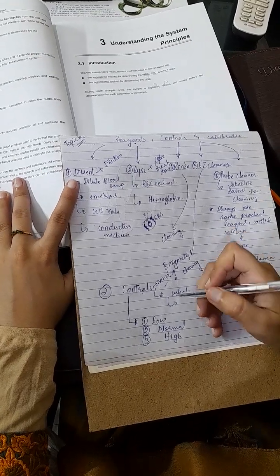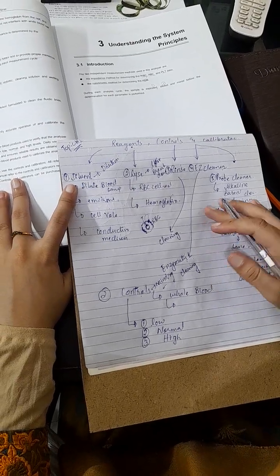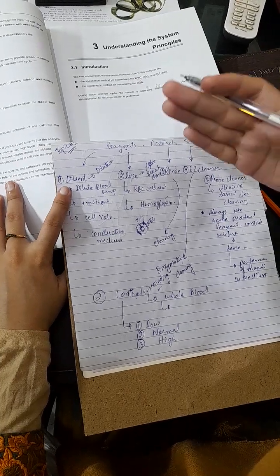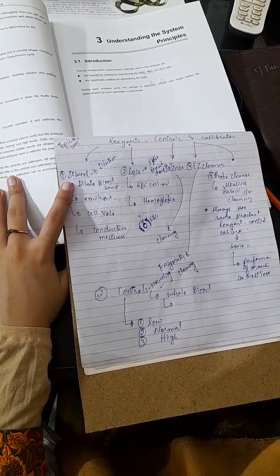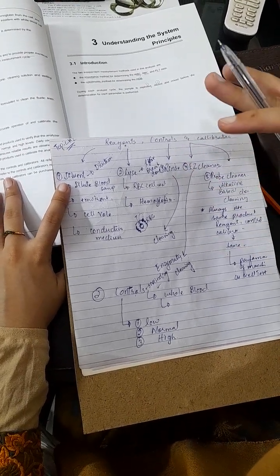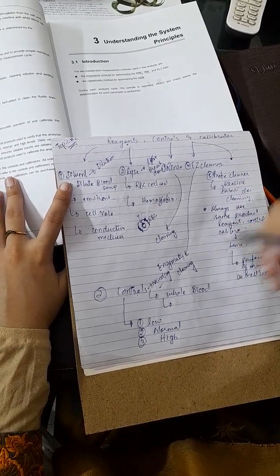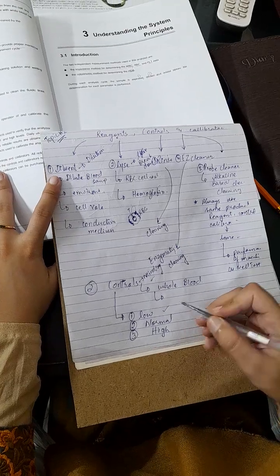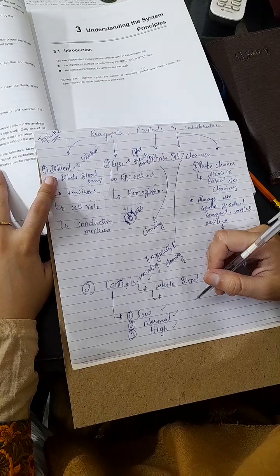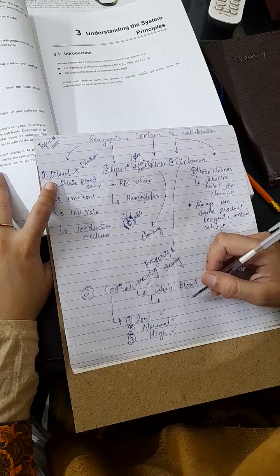Controls are commercially prepared from whole blood and used to verify whether the analyzer is functioning properly or not. If the controls are not within the limits provided by Mindray, or if we use a third party's or make them ourselves, and they are not in the range, it means that our machine is not working properly. Controls are available in three ranges: low, normal and high. Daily use of all three levels verifies the operation of the analyzer and ensures that reliable results are obtained.